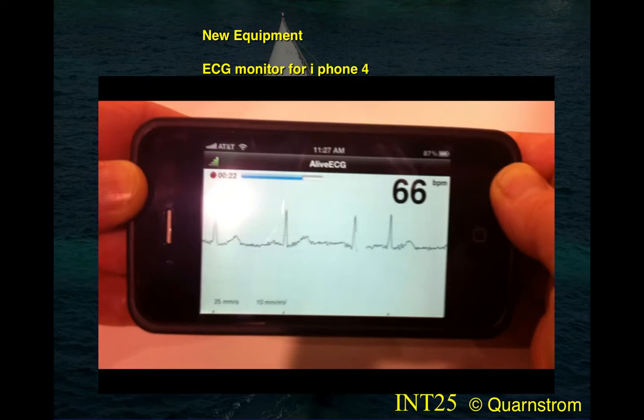Costs around $100. I've used it twice in the office when somebody was doing weird pulse things. I'm a docent at our local museum of flight. I've used it a couple of times there when people were either hot, in one case it was hypoglycemic, they got really shaky. Well, I can put my phone on their fingers and I can tell, hey, their heart's beating at a normal rate, that's good. I've got my pulse oximeter, I know they're saturated, so we probably don't yet need to call the paramedics. Let's see if we can't figure out what's going on.